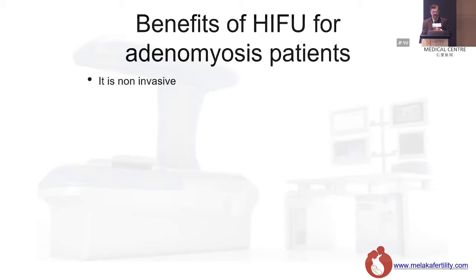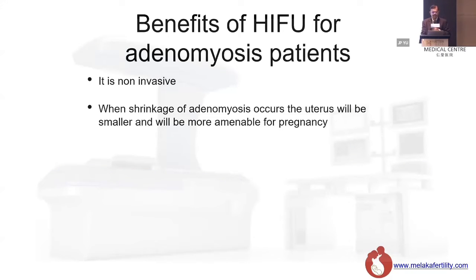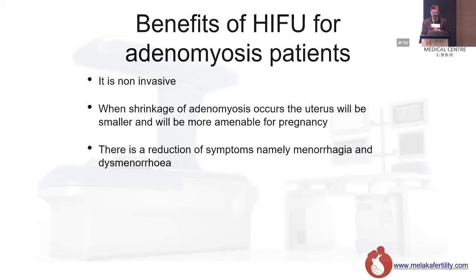I think we have seen this. We know that it's non-invasive. When shrinkage of adenomyosis occurs, the uterus will become smaller and it probably will be more amenable for pregnancy. That's what we are hoping for when we do HIFU for adenomyosis.